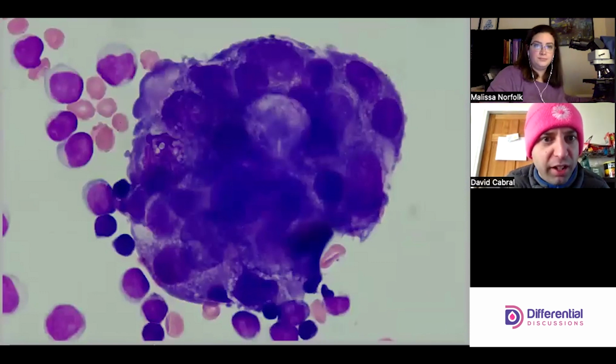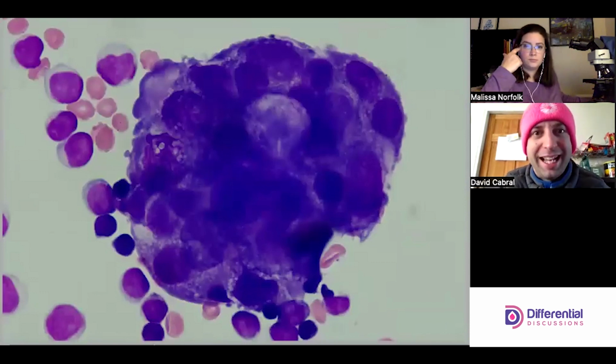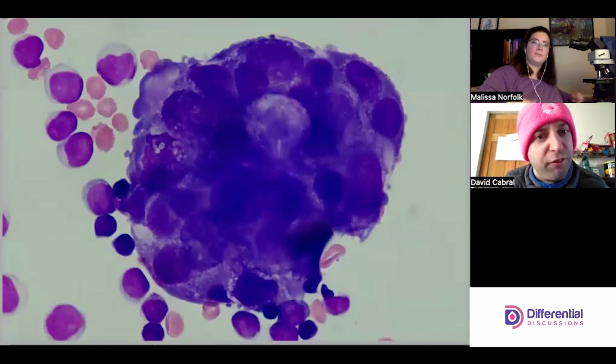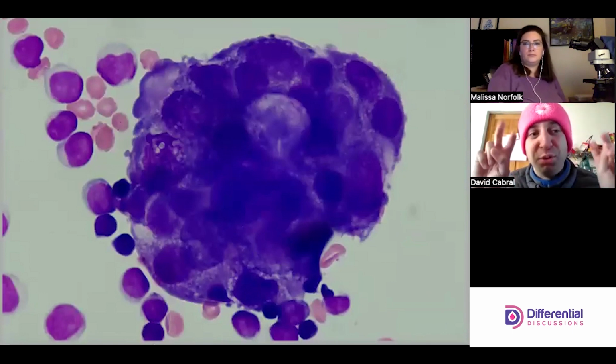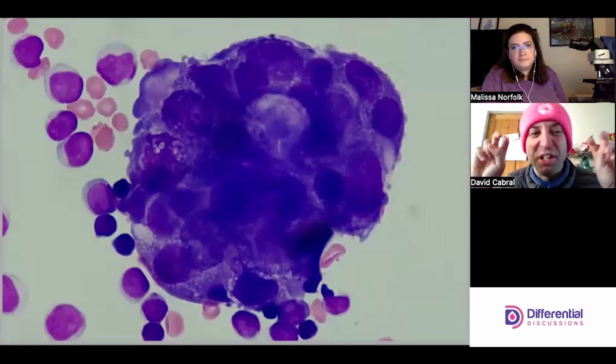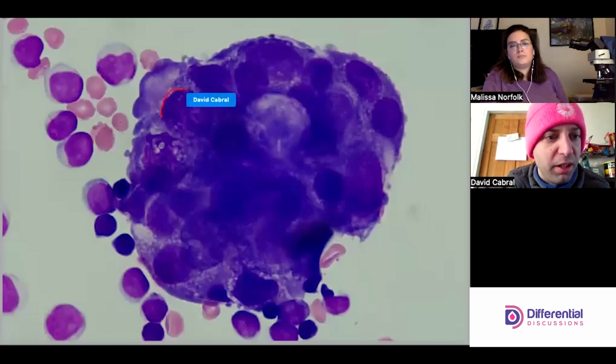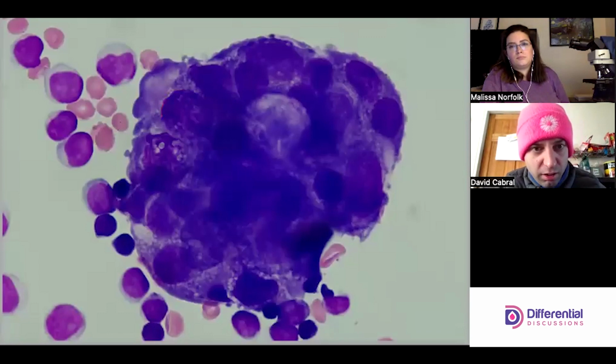So I'm looking to see what evidence I can get from this. The one thing we know for sure is that we have this big blob, and that's concerning. So then I'm trying to focus on the individual cells, heavy on the air quotes, to see if I see any troubling characteristics. This nucleus sticks out to me a little bit, lumpy and bumpy on the edges. I'm seeing it again on this cell here.